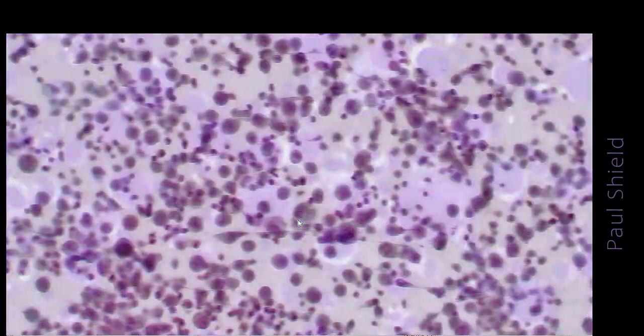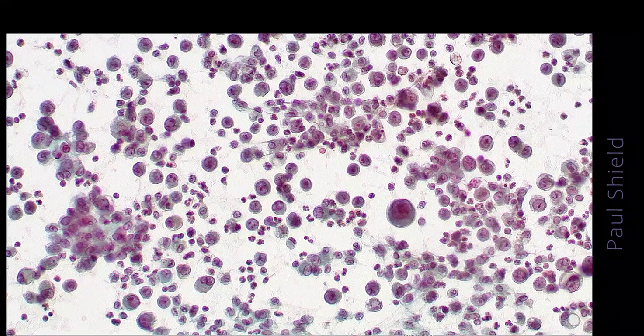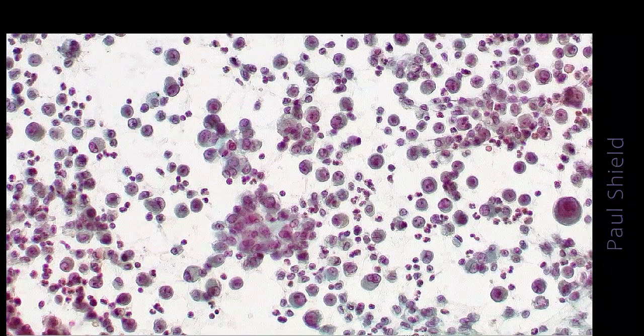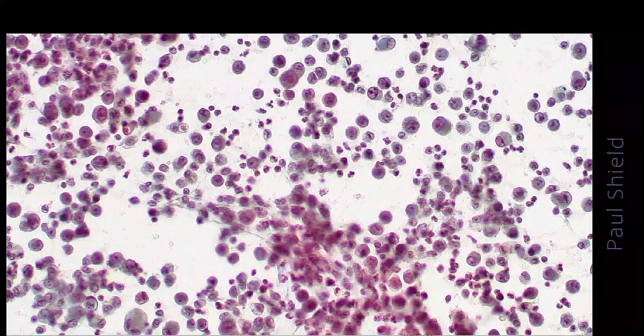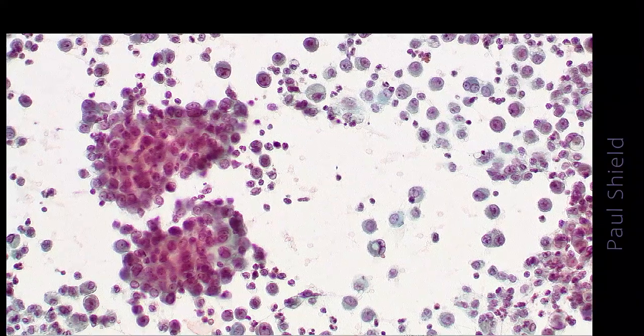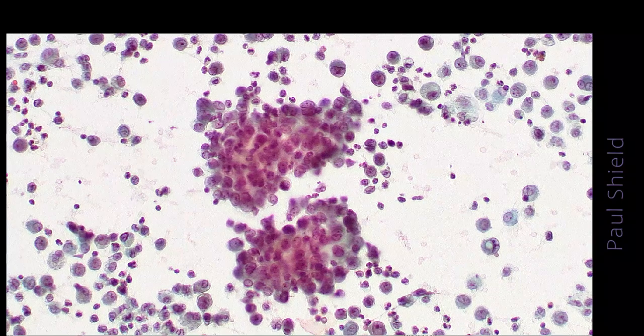They've got prominent nucleoli. This is the PAP stain slides, and again quite dispersed. Some large atypical nuclei, probably groups here. So this one is a matter of scouting around a bit really to find those features, and also to rule out this being mesothelial.